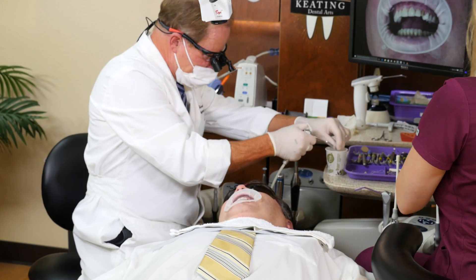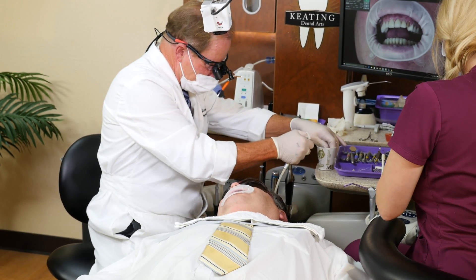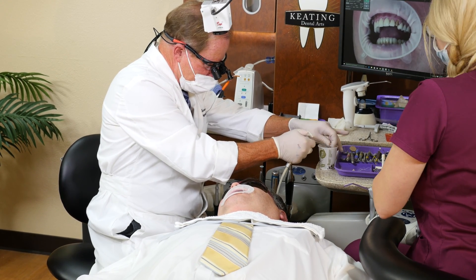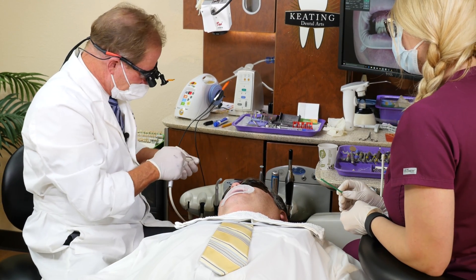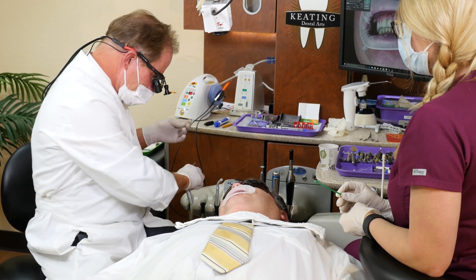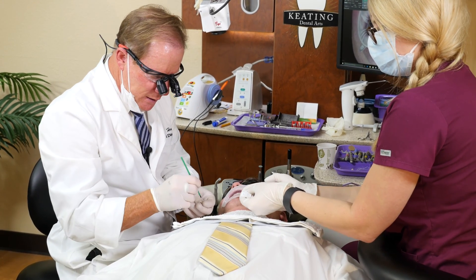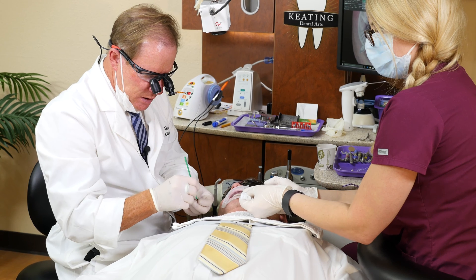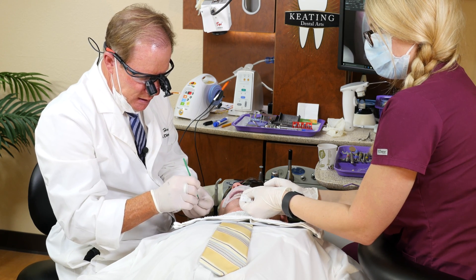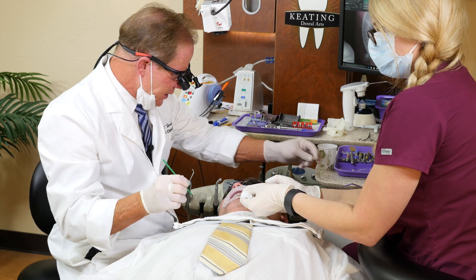We're going to rinse thoroughly and air dry — a very nice, clean, non-contaminated zirconia surface. Then I'm going to use a zirconia dioxide primer, Z-Prime Plus from Bisco. This is similar to the silane you would use for all-ceramic restorations, but it actually gives you a chemical bond to the zirconia. We're going to let that sit for at least a minute and set that aside.